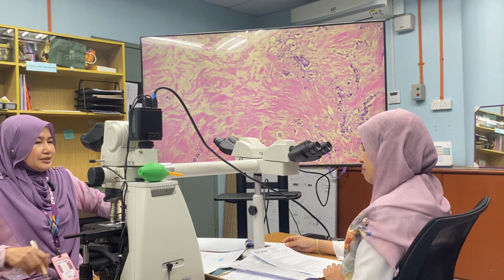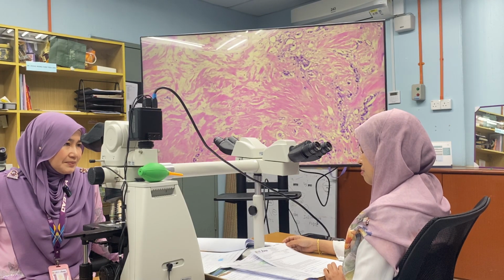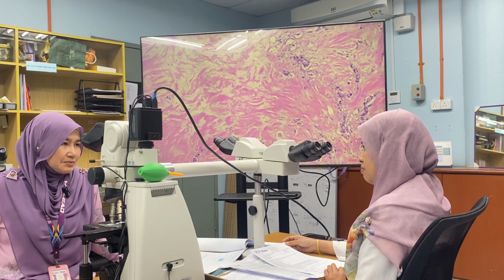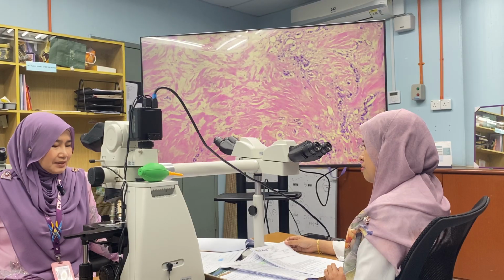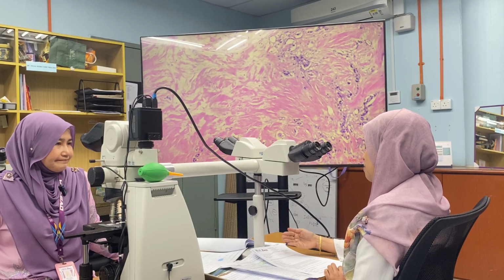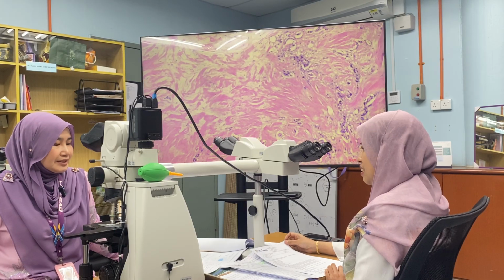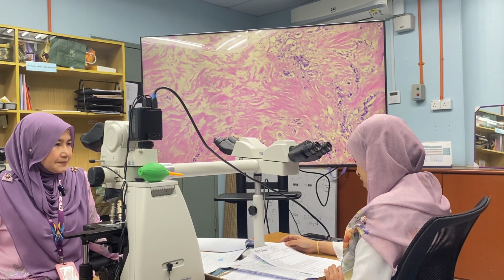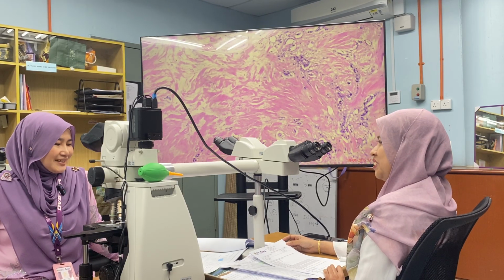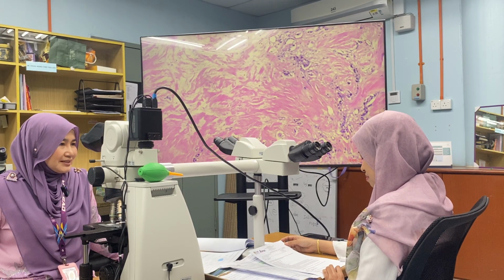Okay. Maybe one last question, because you have not mentioned the tumor marker. Yeah, I know that this case is ER/PR positive previously, right? And HER2 negative. Do you think that we need to repeat the tumor marker for the post chemotherapy specimen? Yes, we need to repeat because the tumor can have a different expression post chemo. So by right we need to repeat, right? Yes. So in this case, do you repeat? I repeat the HER2, which is negative in this patient. I think you did not repeat the ER/PR because it was already positive, right? Yes. That's good enough. But we repeat the HER2, but still negative, right?